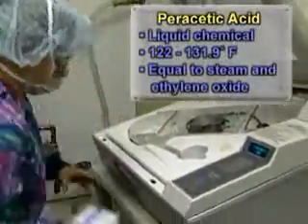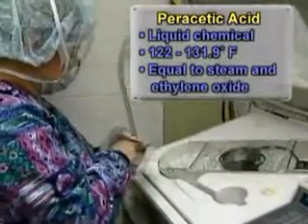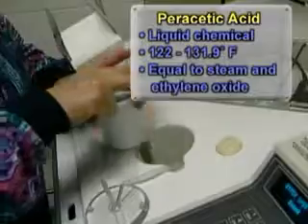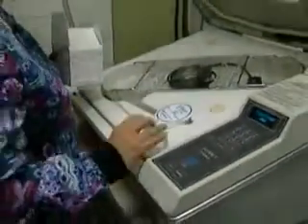Peracetic acid is a liquid chemical sterilization method that uses low temperature of 122 to 131.9 degrees Fahrenheit and is equal in efficacy to steam and ethylene oxide sterilization. It requires the use of a special unit designed for this type of sterilization.